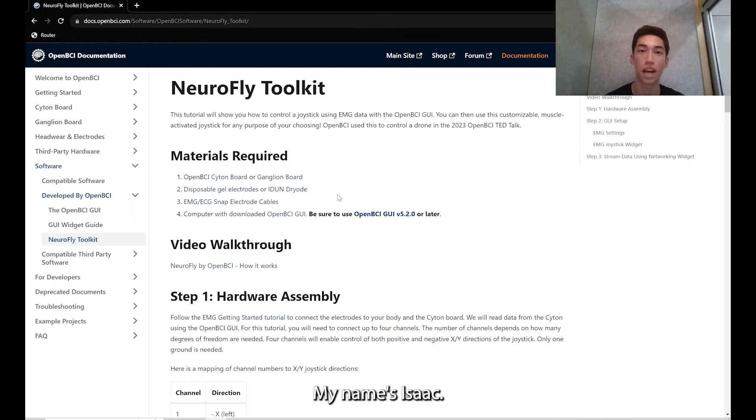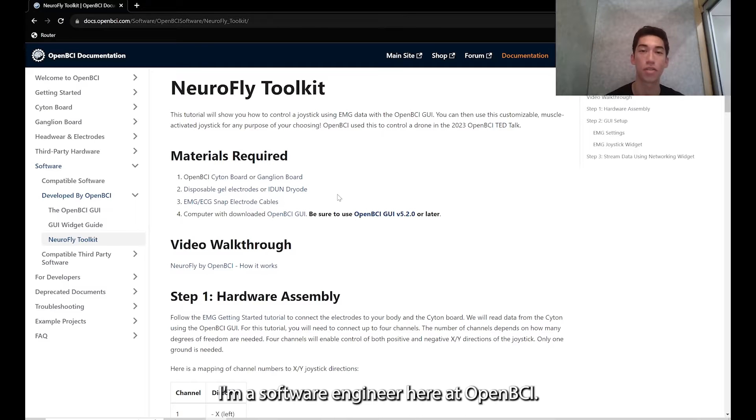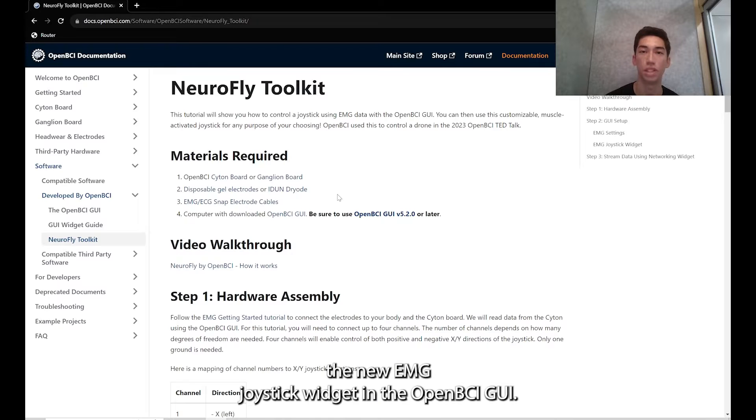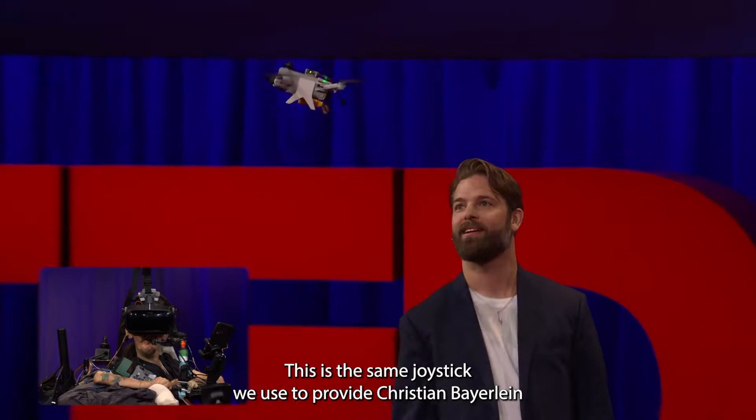Hi everyone, my name is Isaac. I'm a software engineer here at OpenBCI and today I'll be showing you how to set up and use the new EMG joystick widget in the OpenBCI GUI.